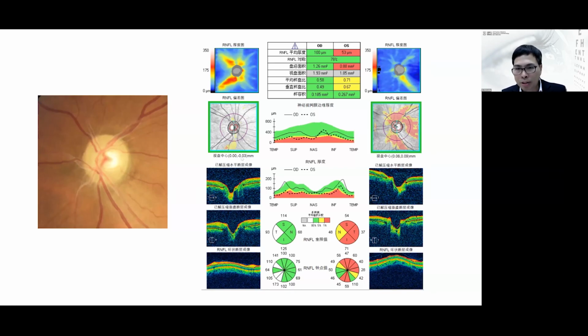Question 5: what happens in a situation where a patient has both high myopia and glaucoma? How would they present? A very good question. We have a lot of difficulties in determining glaucoma in eyes with high myopia because of the tilted disc configuration, because of the unusual configuration of the rim. OCT is extremely useful, but the normative database is not that helpful. So I would typically study the pattern of the distribution of the retinal nerve fiber thickness in the thickness map.